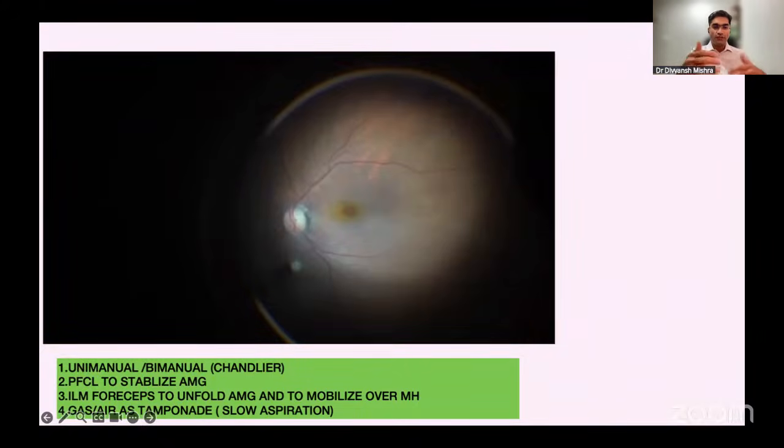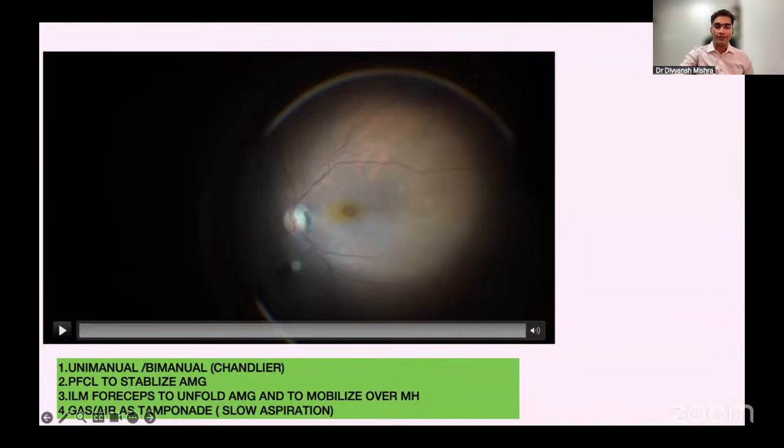So, Bhavik, just to interject and probably calm down the whole nerve. If you had attended our previous sessions, I am the person who would suggest using PFCL for macular holes as a short-term tamponade. We have used it, we have also published. These are very specific cases where we have used it. We kept it for 1 week, 10 days, and then we have removed it, for macular holes where patients cannot maintain position, very hefty patients, neck issues, back issues.